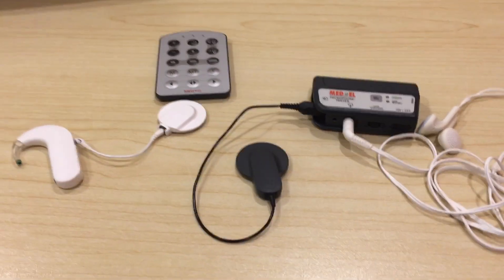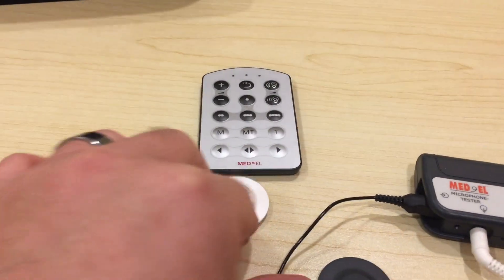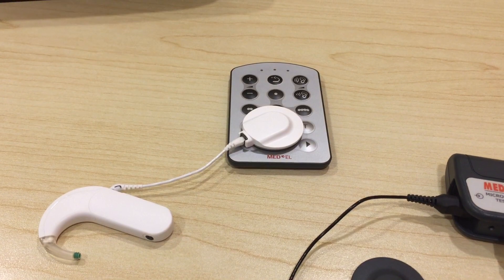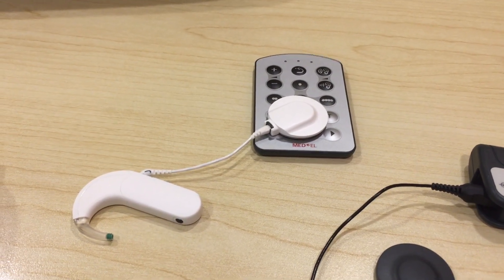To do this, we're going to first start out by making sure that the processor is paired with the fine tuner. Place the coil over the fine tuner, then power the processor off and power it back on.